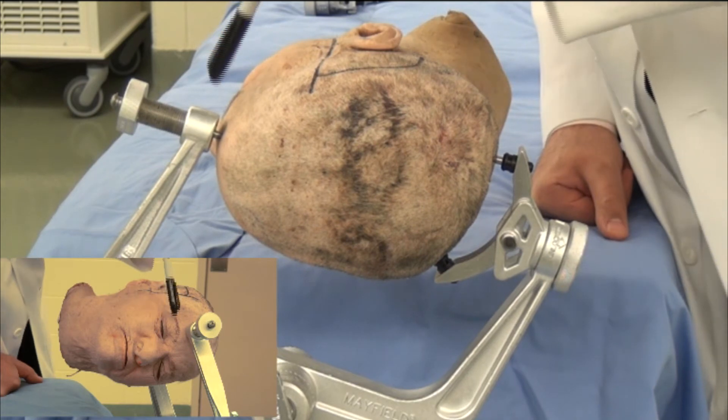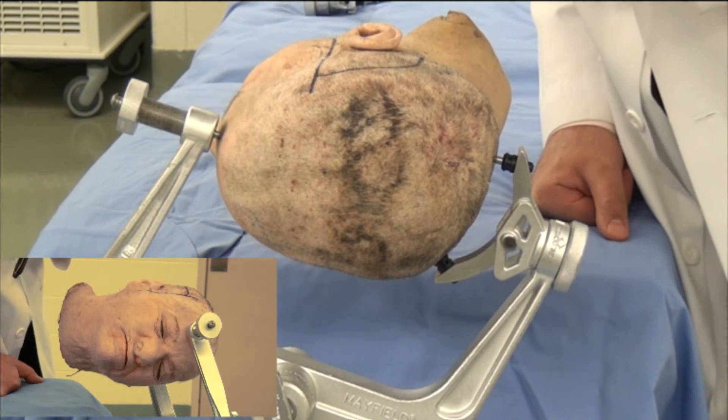Although we have never had issues with the pin violating the outer cortex of the skull and injuring the frontal sinus.